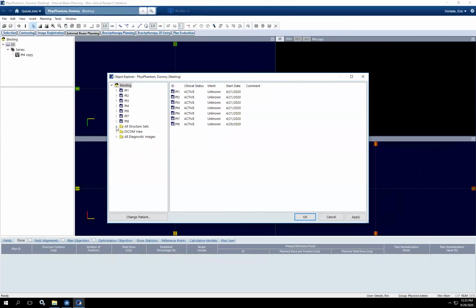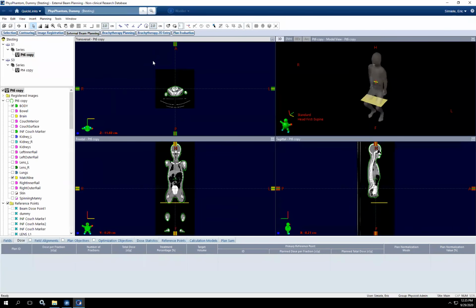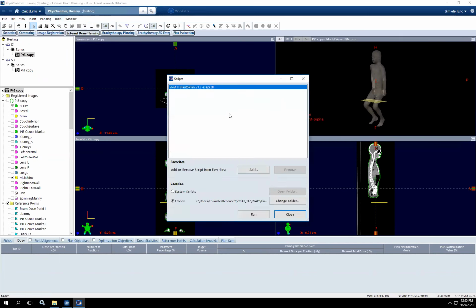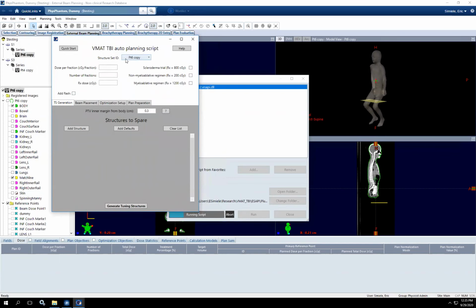And one other thing I wanted to show with it that you can do is, here is a case for a patient where we actually want to treat with VMAT and APPA, and we have the match plane drawn in yellow here. So this script is equipped to handle both cases easily. So we go ahead and run it. You see the patient's name is populated up here. This patient was treated with a myeloablative treatment regimen, so we can go ahead and select that.